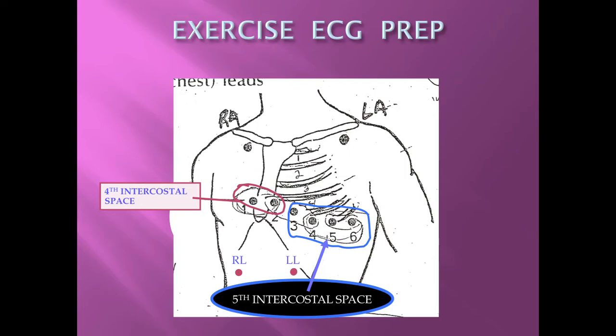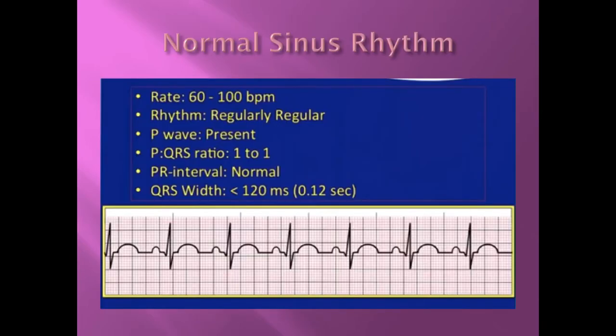Right? Baseline prep, we went over this, and what we didn't go over in class. So primarily, we're looking for normal sinus rhythm for our patients in lead 2. What we're looking for first always is a rate. Do we see a normal rate at rest between 60 and 100? Next we'll talk about sinus bradycardia or tachycardia. These aren't things that are issues to really worry about, but the ECG printout will tell you that they exist.